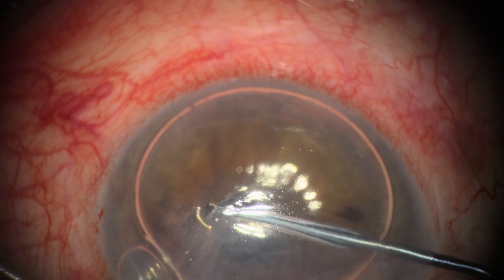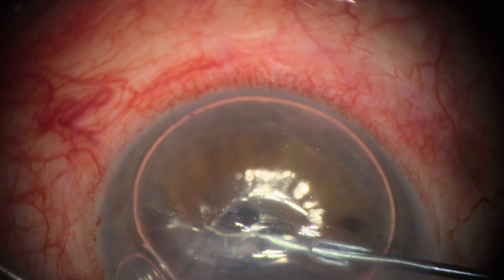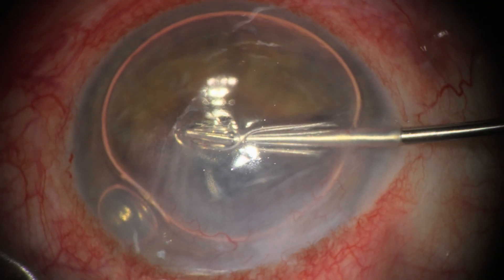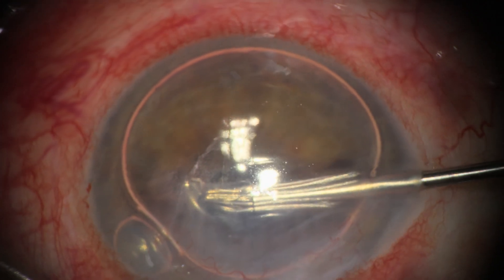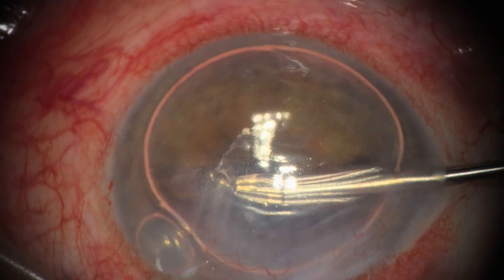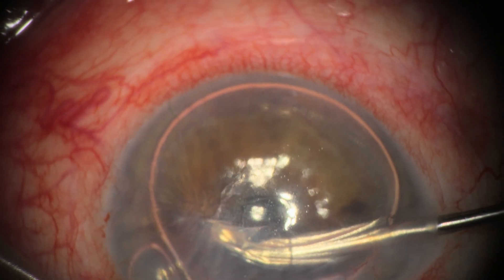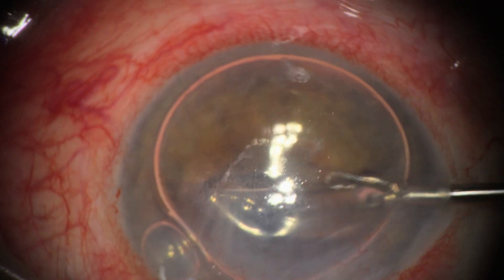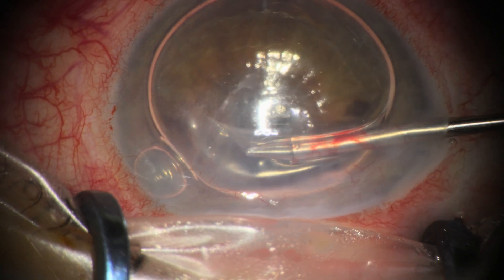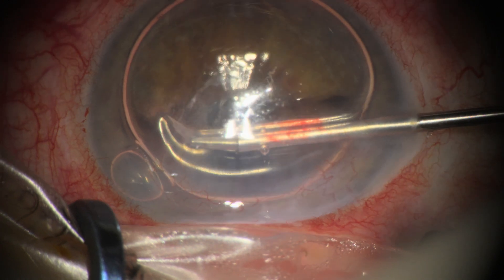Here we are in the OR a year later, using air as a mirror — as described by Meles in his DALK technique — to visualize and pick at the membrane, trying to grasp it with coaxial forceps under a bit of viscoelastic at the tip of the reverse Sinsky. This is very similar to what we do in DMEK during descemetorhexis, and we were also guided by intraoperative OCT to ensure we were stripping the membrane and not Descemet's membrane.